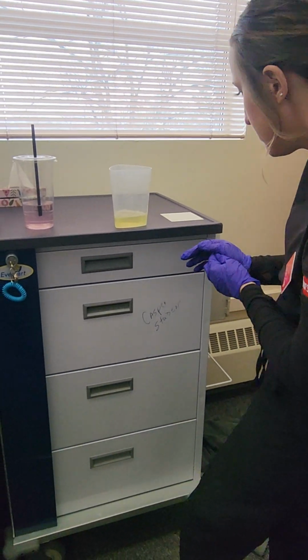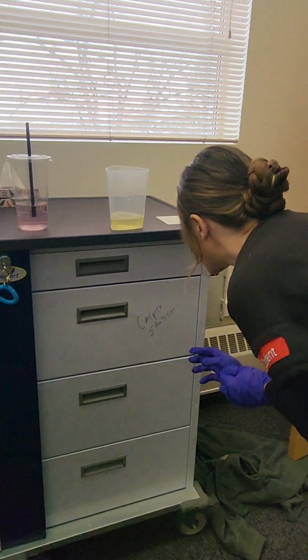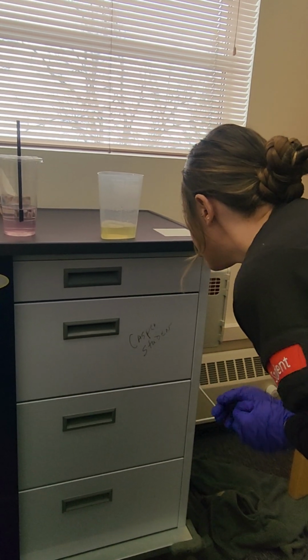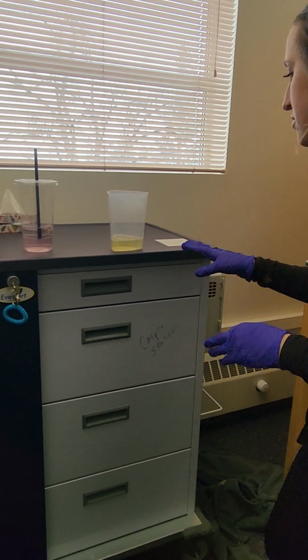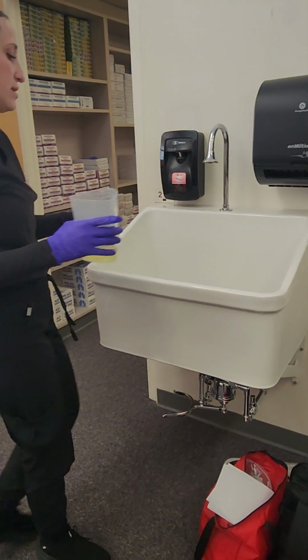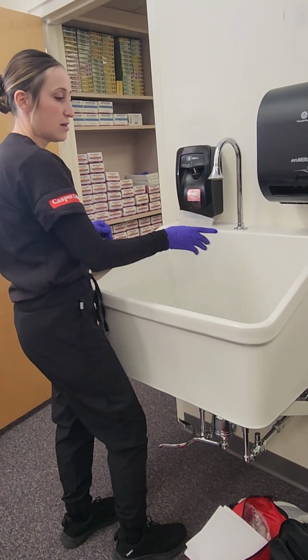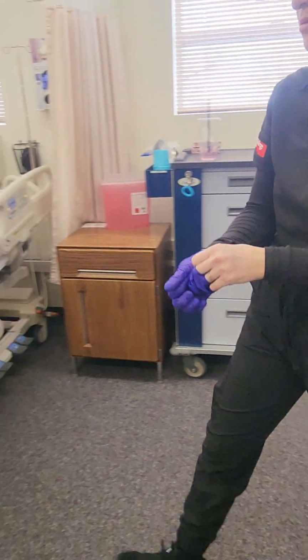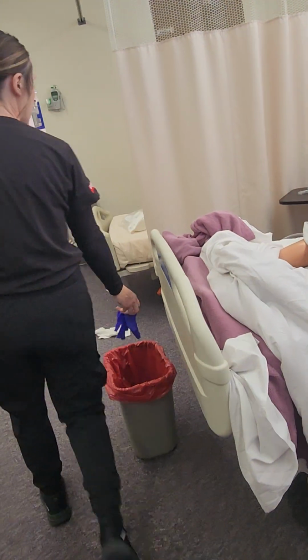Set this on a flat surface. I'm going to note that I have 150 milliliters, noting the color, clarity, and any odors. This is his toilet. I would put this in the toilet, rinse, put this where it belongs. And then I'm going to remove my gloves and hand hygiene again.